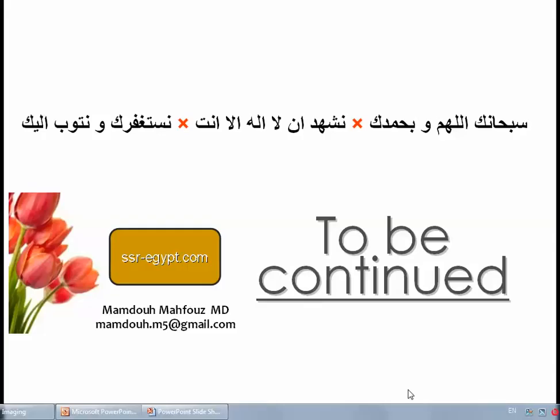Dear colleagues, now we will continue the topic of MRI or imaging MRI of the knee joint. We have started the evaluation of the knee joint, and we discussed the anatomy as well as the technical aspects and the meniscal pathology.